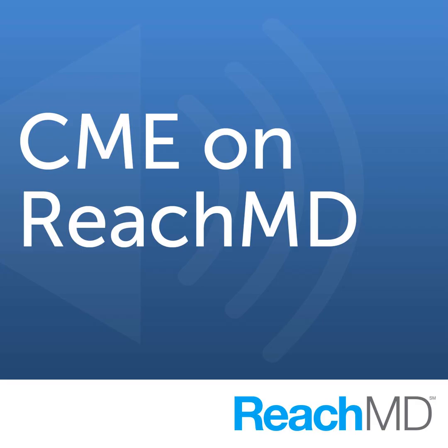There are really hemodynamic problems in the LVOT, and there it's extremely important to assess the obstruction, and that is a 1B, the gradient itself using echocardiography. And there are clear definitions how to get it done when it can be dangerous. But here again, I would say, if it's 50 or 55, it heavily depends on the loading conditions of the disease.